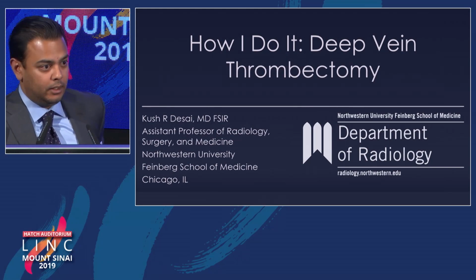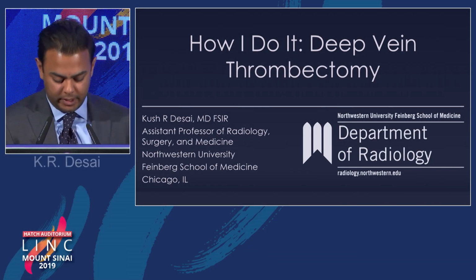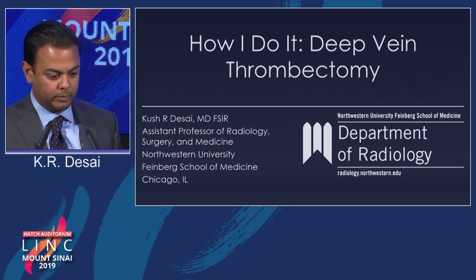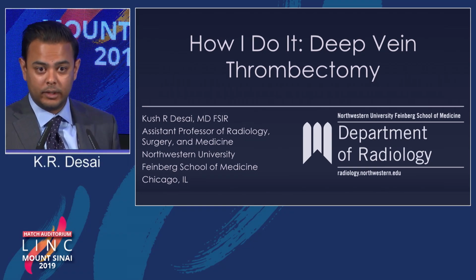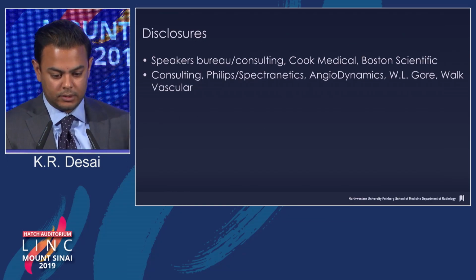I'll go through briefly what my approach is to doing acute iliofemoral thrombectomy. I do say iliofemoral because that's the way I practice, and certainly now we are supported based on the ATTRACT sub-analysis. These are my disclosures.